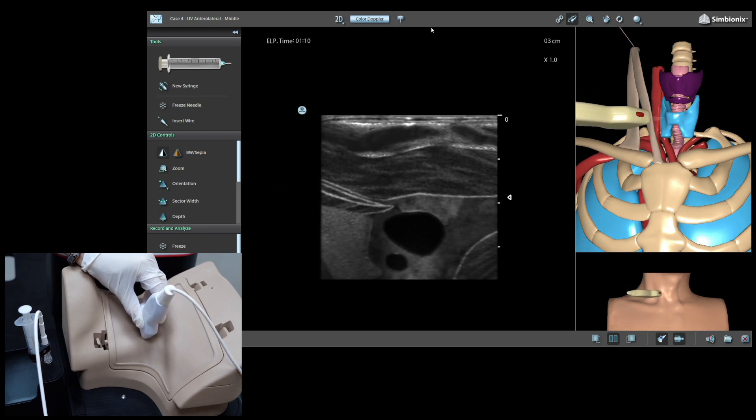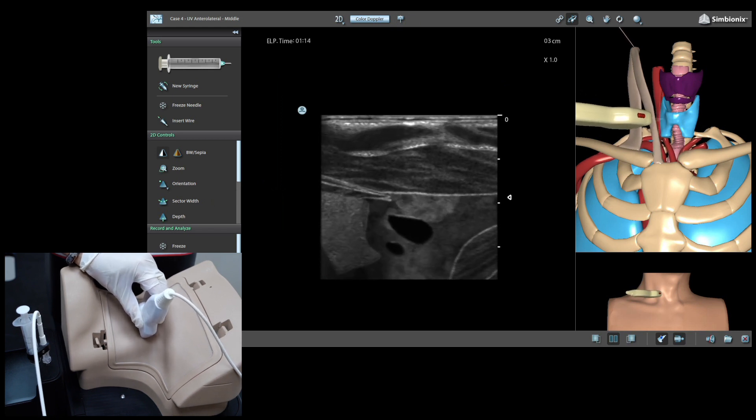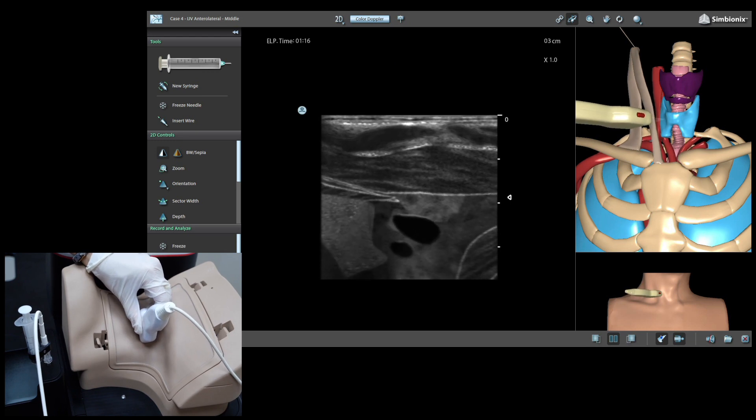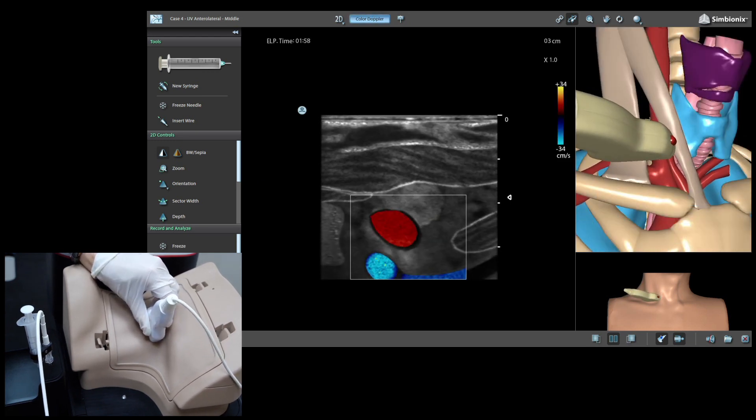Importantly, by applying slight pressure with the probe, we will verify internal jugular vein compression. Color Doppler can also be used for full assessment.